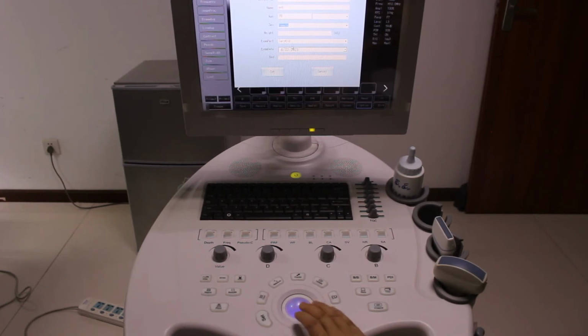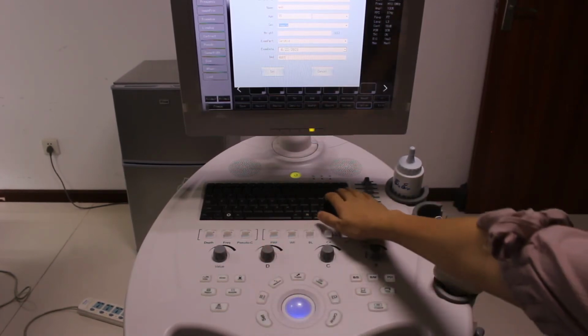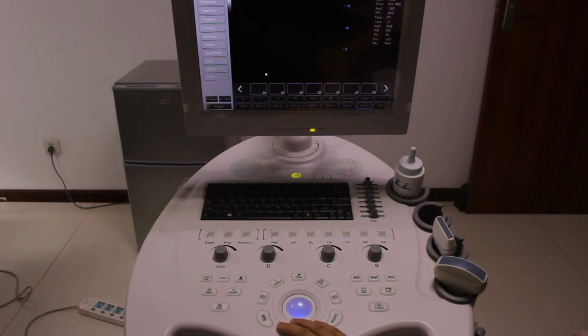Carotid, okay. The exam part you can choose, or the exam date, the bed number. Press set. So you can see the patient name, NMD, female, 35. It's coming out.